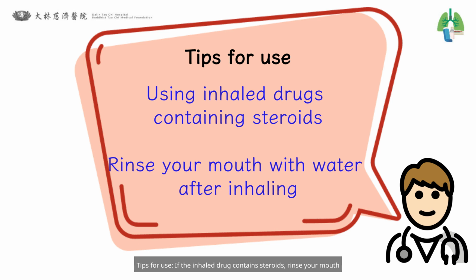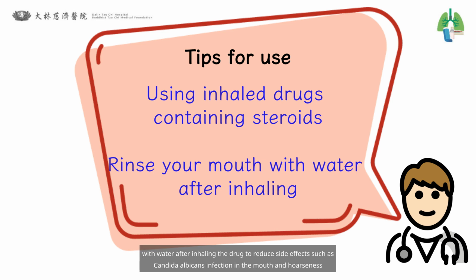Tips for use: if the inhaled drug contains steroids, rinse your mouth with water after inhaling the drug to reduce side effects such as Candida albicans infection in the mouth and hoarseness.